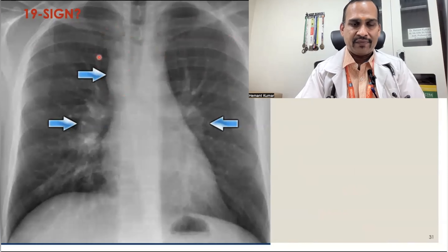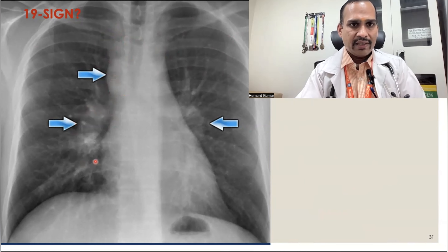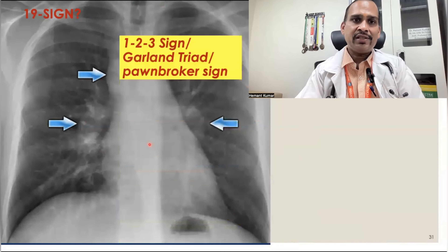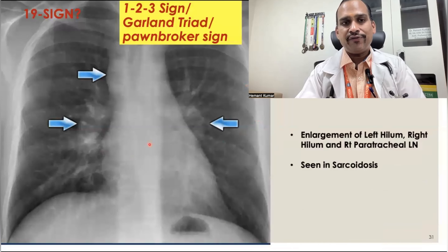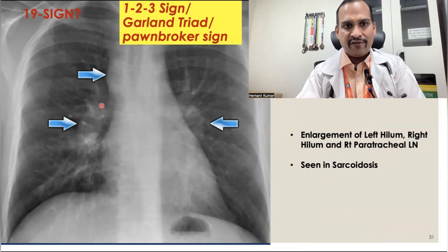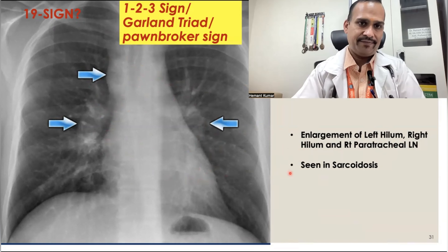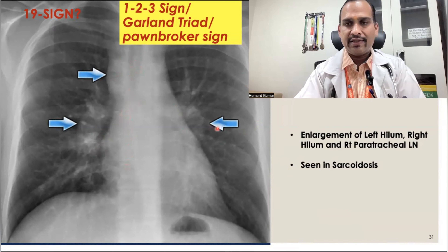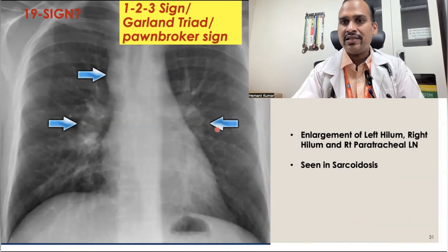Sign 19 is the 1-2-3 sign, also called the Garland triad or pawnbroker sign. You can see prominent paratracheal nodes, right hilar nodes, and left hilar nodes — all three groups are enlarged. Whenever there is enlargement of these three groups of lymph nodes — left hilum, right hilum, and right paratracheal — it forms this pattern. It is seen in sarcoidosis. It is also called the lambda sign, because drawing lines connecting the lymph nodes forms a lambda shape.